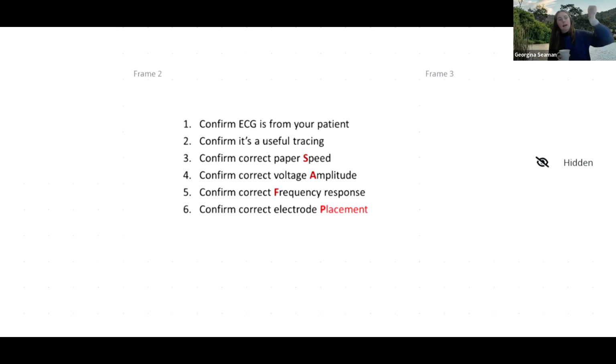But it will be 2 of the large squares. Is that right, Anita? So will it always be a centimeter? Is it always calibrated to 10 mils on the ECG? I think so. As long as it corresponds, you can break it down. You can look at the small boxes and the big boxes, and knowing how much each of those are worth, you can look at it manually as well and then correspond across. But yes, it should be 2 large boxes, and that is that sort of square thing that's next to your ECG.